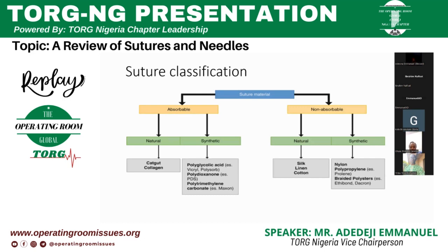Sutures and needles: some are attached together, mounted together, and some are prepared separately. So in the classification of sutures, the general classification is absorbable and non-absorbable, and we also have synthetic and naturally occurring.